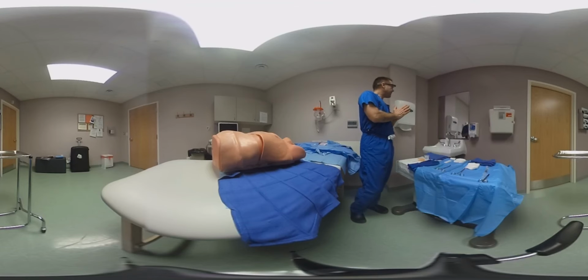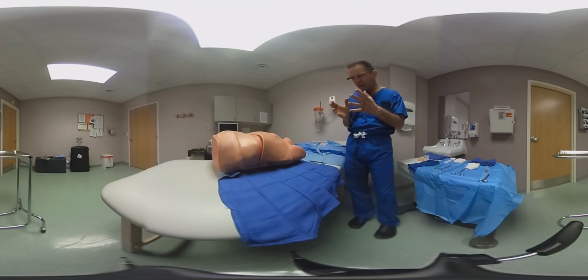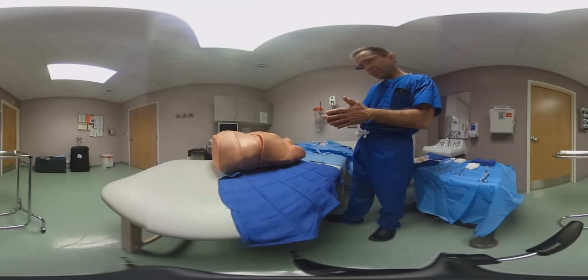Well, good morning. My name is Dr. Grossman. I am a trauma surgeon, and I wanted to show you today a demonstration of a chest tube insertion, or a tube thoracostomy. I have a simulated platform. It's a Trauma Man from Simulab Corporation, which is very interesting because it's very realistic.